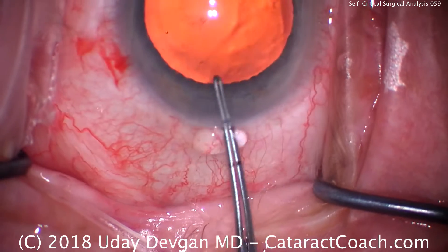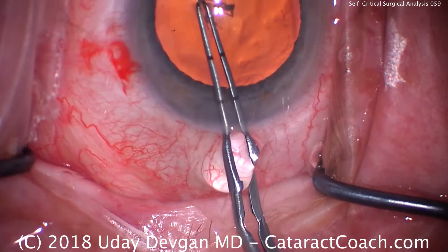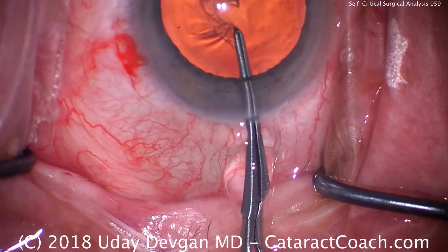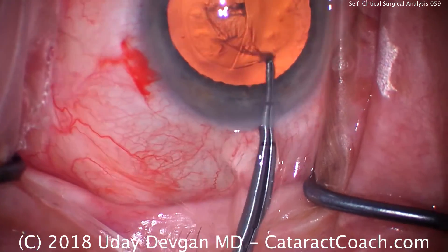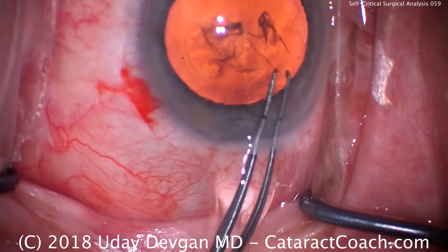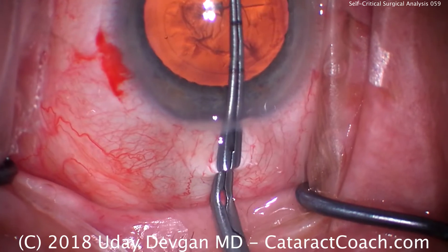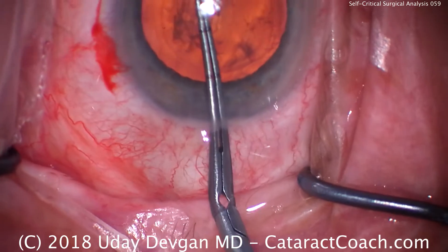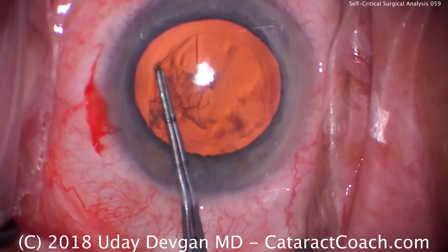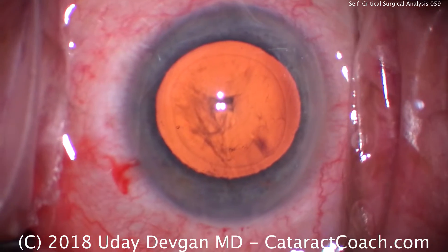Time for our capsular rhexis. It would help if I center the camera a little bit better. Here comes the rhexis. Don't confuse the rhexis flap edge for that LASIK edge that you also see there. The view is a little off the field — the microscope view is bigger so I'm still seeing what I'm doing, but it would be nice if I did a better job of centering the camera. We have a rhexis done here.